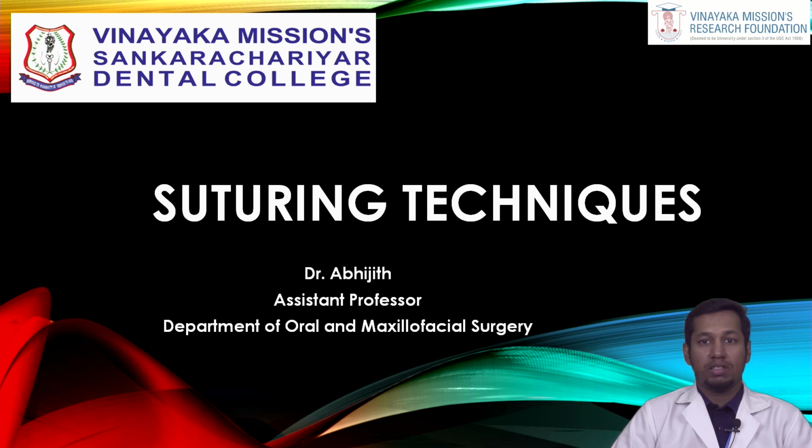Today we are going to study about suturing techniques. So what is suturing? Suturing is basically required in the field of oral and maxillofacial surgery. It is a routine procedure done in oral and maxillofacial surgical cases at the end of the procedure. It is basically required for closure of the wound or operated site.